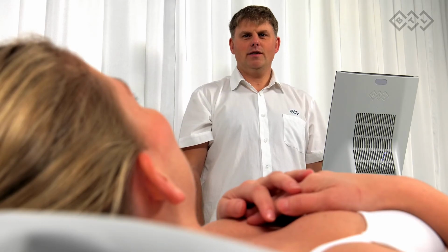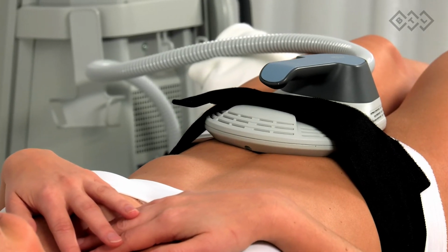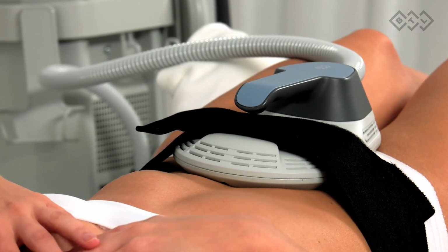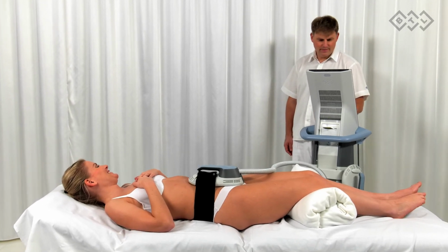It is important to maintain verbal contact with the patient during the treatment. Ask them how they feel, adjusting intensity accordingly. The patient should feel intense but tolerable contractions without any pain. Keep checking for comfort level and contraction intensity regularly.